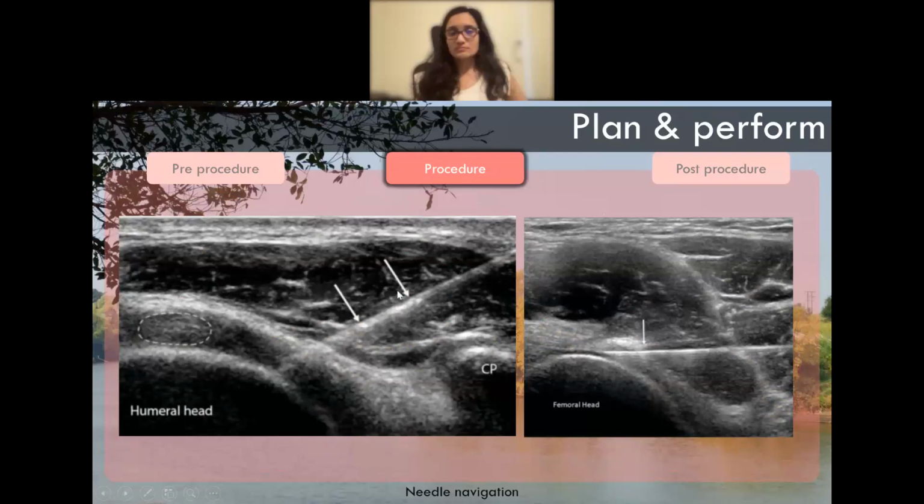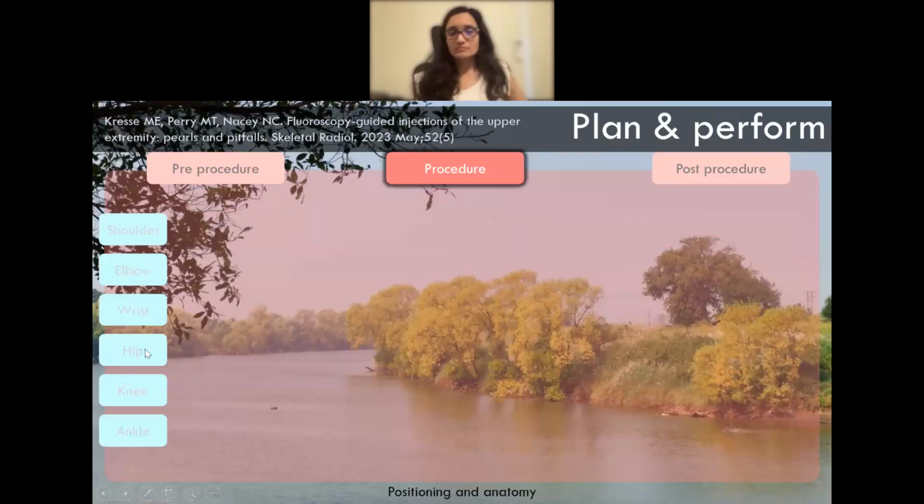Okay, so here we can see the two ways. This is the shoulder joint through the skin and deltoid. The needle by the lateral approach has entered into the joint cavity. This is the rotator interval where we are seeing the beveled edge touching the articular cartilage at the humeral head. Whereas here, this is a lateral approach that has been done in a case of hip joint, where we can see the beveled edges conforming to the convexity. In such cases, we can easily navigate through the joint space without even damaging this articular cartilage.